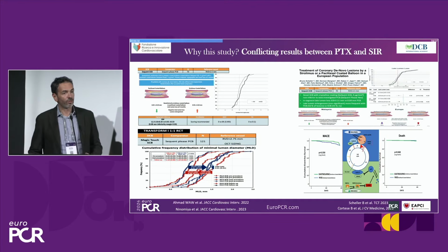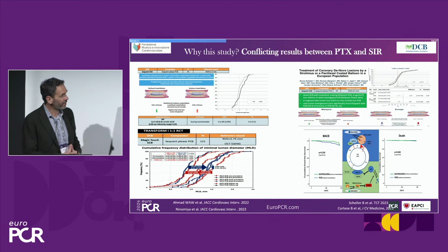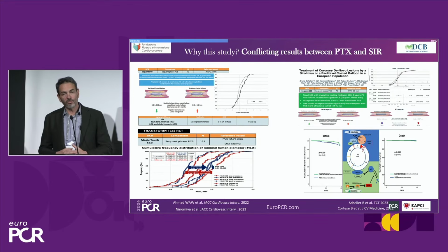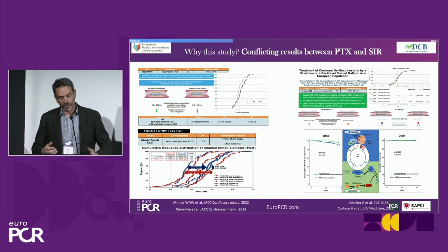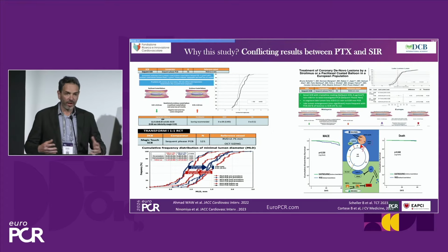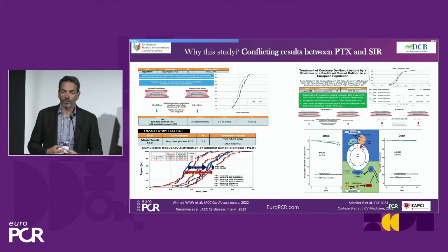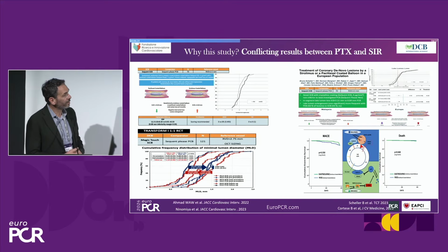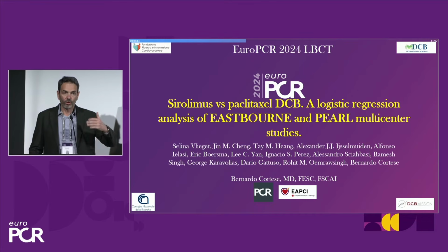But now let's come to one of the hottest topics in interventional cardiology so far: is paclitaxel better than sirolimus, or is sirolimus better? I don't have a definite answer. There are several small studies trying to address this. As Marie-Claude and Antonio were saying, we don't have a direct randomized comparison with a clinical outcome. We have discrepancies. We have bad results for MagicTouch with the Transform-1 study, where non-inferiority was not achieved compared to SeQuent Please, but that study, which I was part of, has several flaws, with a huge number of discrepancies among the centers. So this is why we decided to go deeper into understanding if there is a difference.